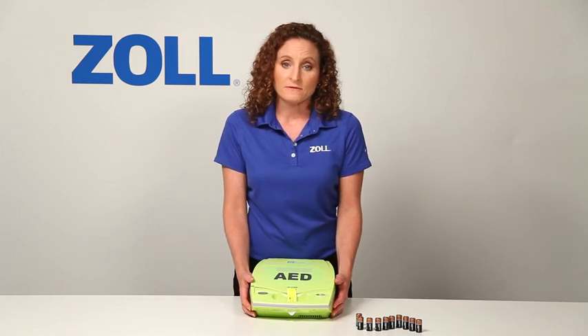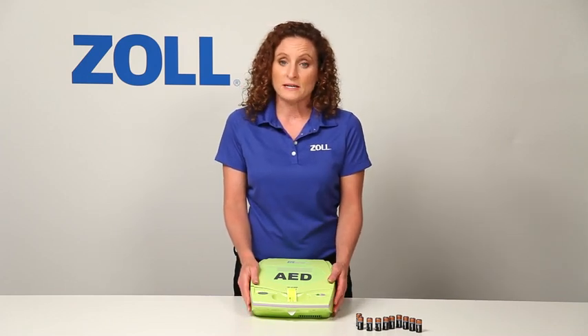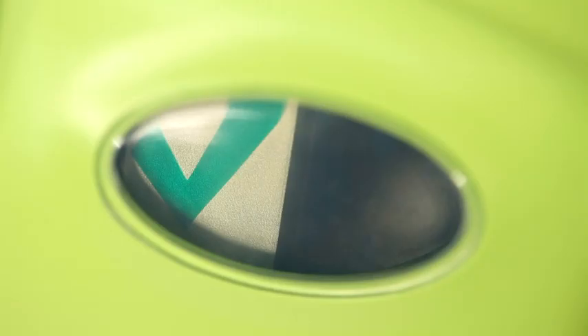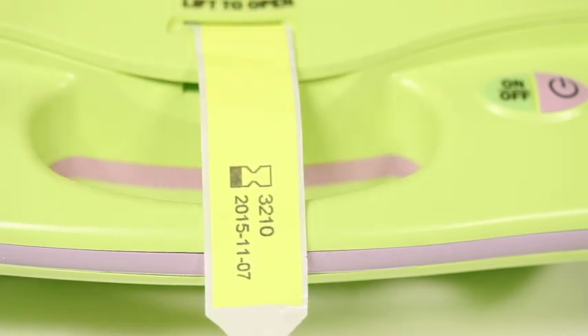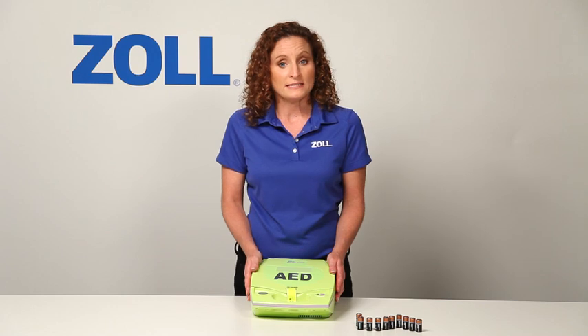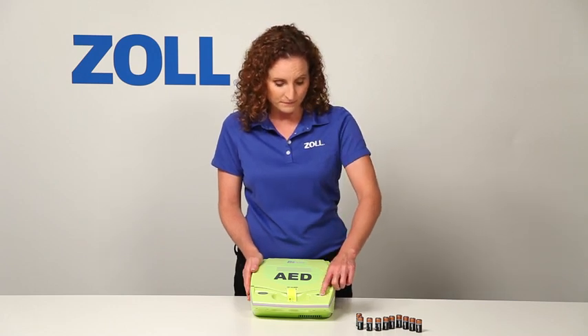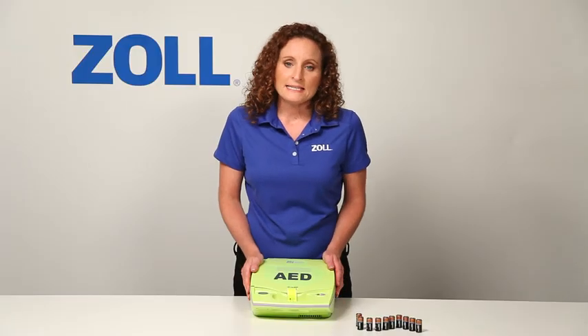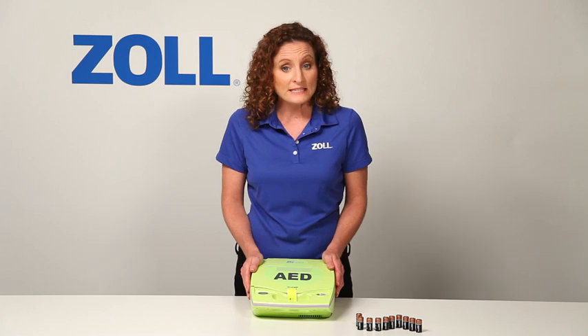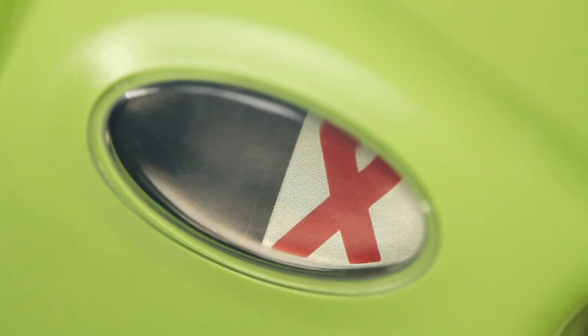These batteries are relatively inexpensive compared to proprietary battery packs that other manufacturers sell. Notice how easy it is to inspect the readiness of the AED. Check the expiration date of the pads by looking at the date printed on the tag that extends from the lid. You can conduct a self-test of all critical components by pushing the on-off button down and holding for 8 seconds. The AED Plus also performs the same test automatically on a regular basis, presenting a green check if it passes, or a red X and a beeping alarm if it fails.